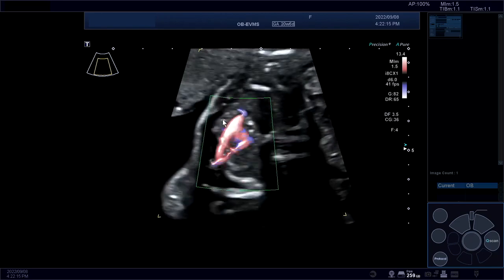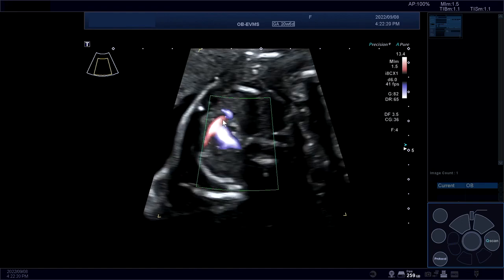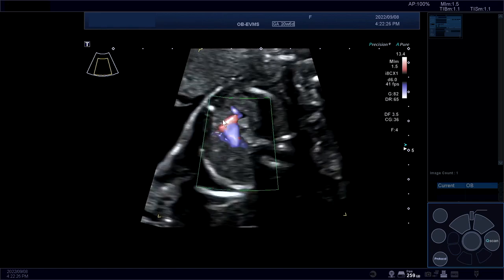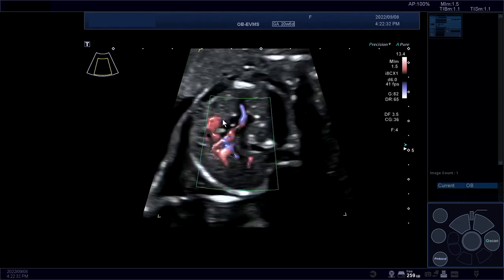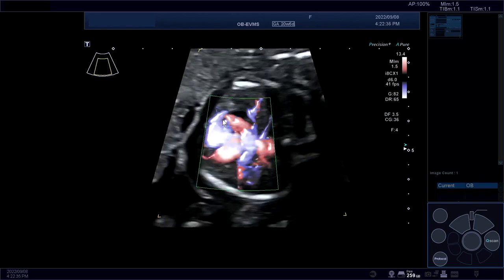The brachiocephalic vein, we'll talk about it tomorrow, is really important, especially when you have persistent left superior vena cavas, total anomalous venous return of the supracardiac type, and so forth. So that's the anatomy showing from the bottom up. Now, if I want to see the pulmonary veins, I'm in a good orientation here.